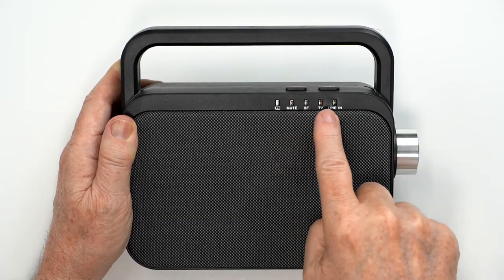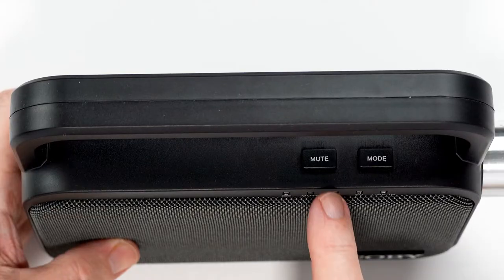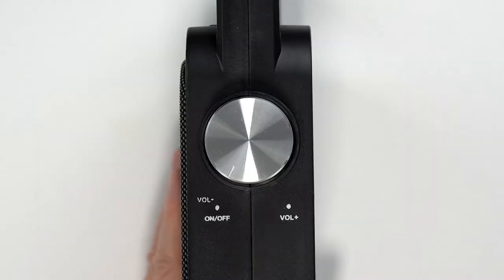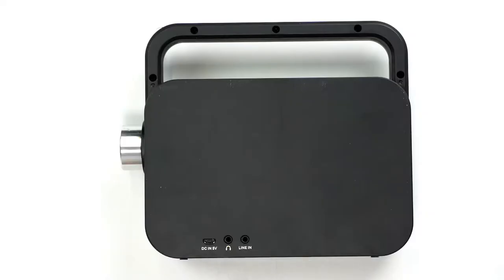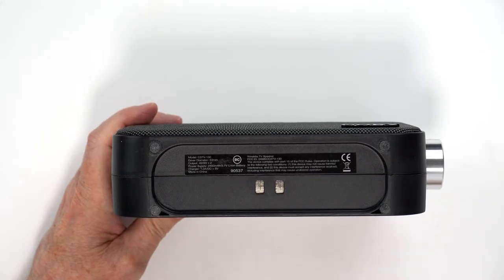On the front of the speaker are the indicator lights. On the top is the mute and mode button. On the side is the volume and on-off dial. On the back is the charging port, earbuds or headphones jack, which I will demonstrate later, and an auxiliary or line-in port. On the bottom is the connection for the charging dock.